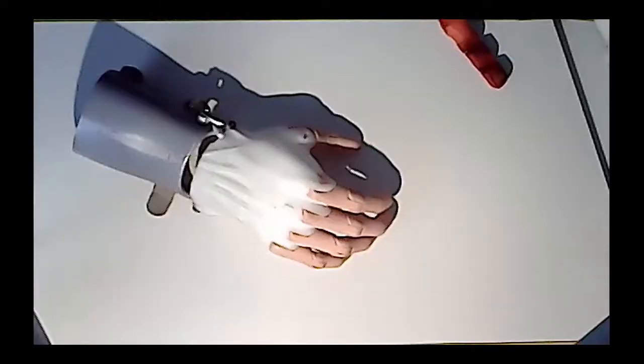We keep in touch with them, and our commitment is that we will follow the needs. The needs could change, like the first guy with the arm, the Batman: he doesn't want an arm anymore, but he wants a specific terminal to ride a bike or to eat or something else. So we keep the contact with everybody, and when they grow and when they need something special, bigger, we will do another release of their solution, and they will benefit from our increased knowledge and solutions and so on.